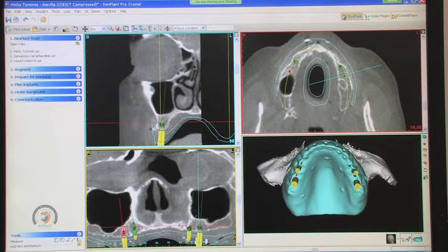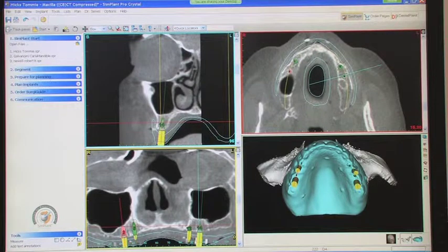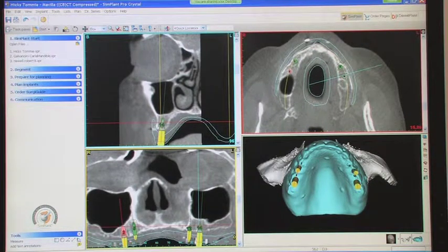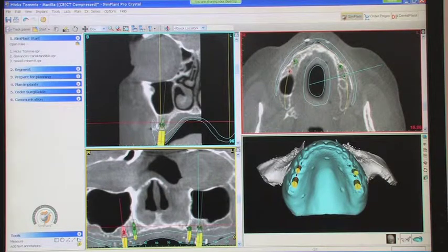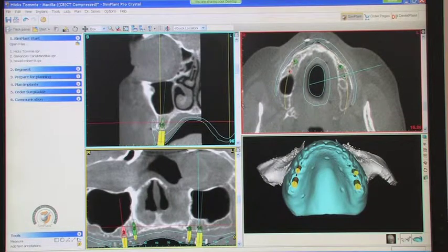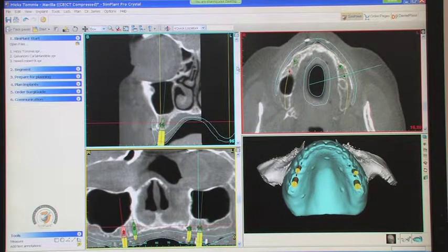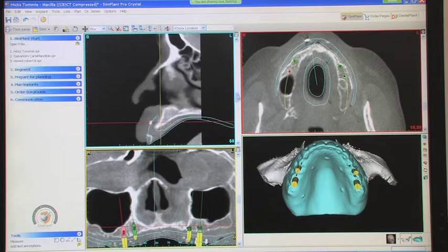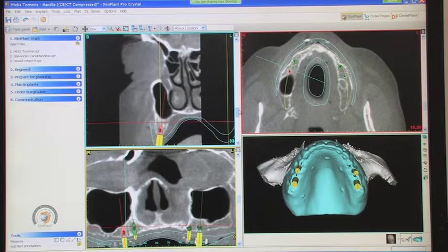This is probably the panoramic view — you can see nice clear sinuses, but you can see where the sinuses drop down. You do have an amount of bone to work with in the premolar-molar area, and the same thing on this side.